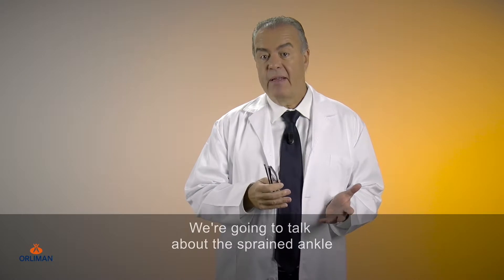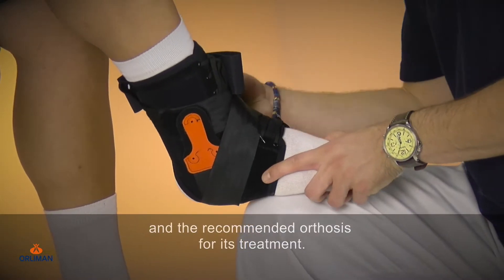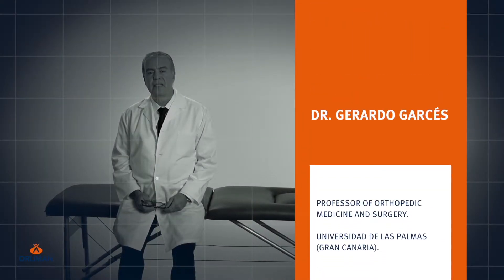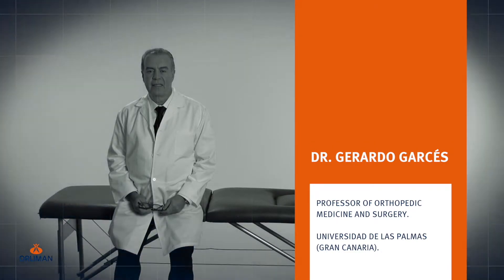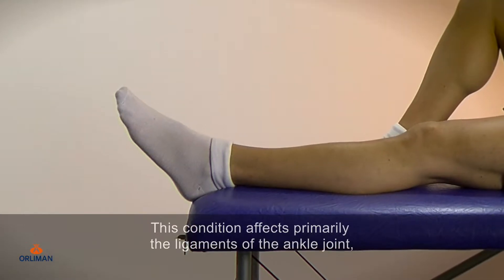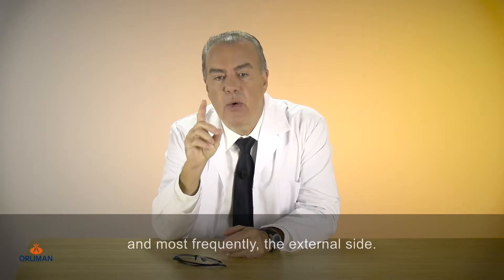We're going to talk about the sprained ankle and the recommended orthosis for its treatment. This condition affects primarily the ligaments of the ankle joints and most frequently the external side.